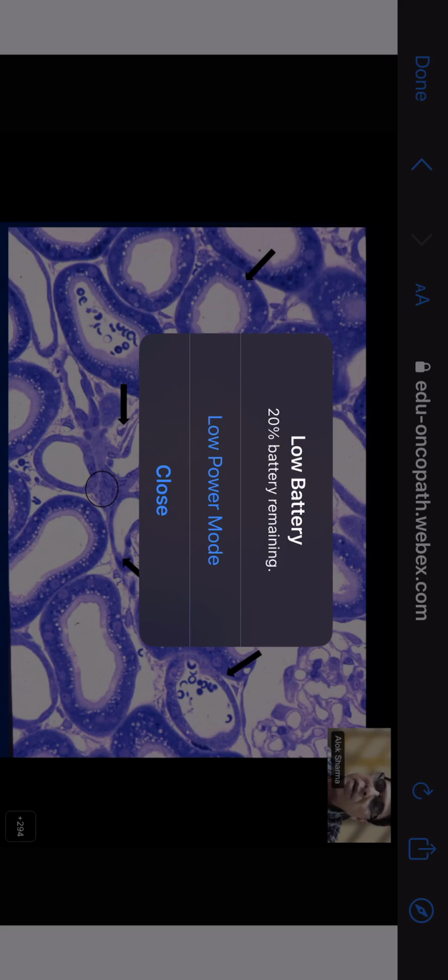And this is a distal tubule which has some RBCs in its lumen also, which has got a flattened kind of lining. So this is a distal tubule. And in between these proximal and of course distal tubules also, you can see small thread-like structures similar to what you saw in the glomerular capillaries. So these are called peritubular capillaries. They have a lot of importance when you look at transplant biopsies, right?